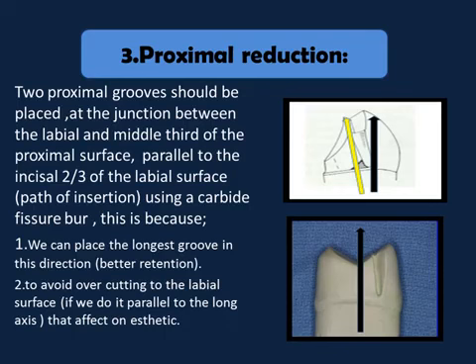And this is because we can place the longest groove in this direction for better retention and to avoid overcutting the labial surface. If we do it parallel to the long axis of the tooth, that may affect the aesthetics.